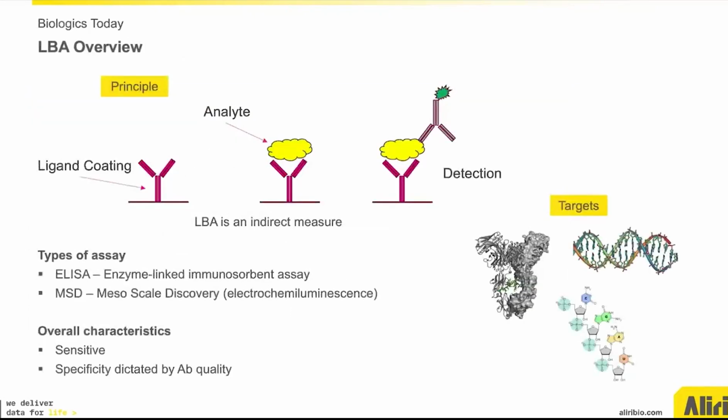Traditional LBA assays are used to quantitate large molecules like antibodies, DNA, RNA, biosimilar, and fusion proteins. For LBA analysis, ELISA and MSD are most commonly used in PK evaluations. These methodologies will require one or two critical reagents to capture and detect the biologic.